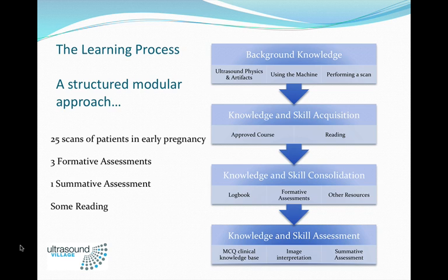I also think some formative assessments are very important. And again, this is not my personal thought, this is thought around clinical ultrasound teachers around the world. A formative assessment is a structured teaching tool whereby you do an ultrasound with an expert who goes through a stepwise process of making sure that you don't miss anything out and you understand what you're doing. It's like an intensive supervised ultrasound. So 25 scans independently by yourself of early pregnancy patients, 3 formative assessments. You can do any reading, go to conferences, courses, whatever you like.